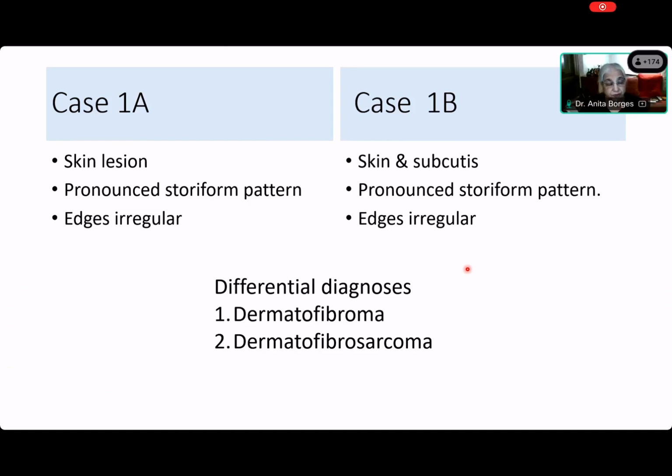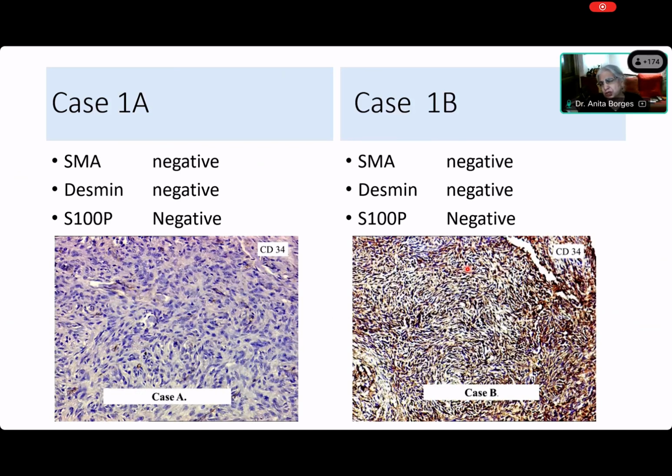If it is very large, very infiltrative, and full of mitoses, then yes, you can call something that is storiform and in the skin a dermatofibrosarcoma. Otherwise, you cannot do it. So this is one of those things that is so simple. You make all the observations that are required, and we have made all of them: that it's in the skin, it is storiform, the edges are irregular. The age doesn't matter, nothing matters. You have to resort to immunohistochemistry. You can make a guess, and some of you have made a guess, and I call those an educated guess.